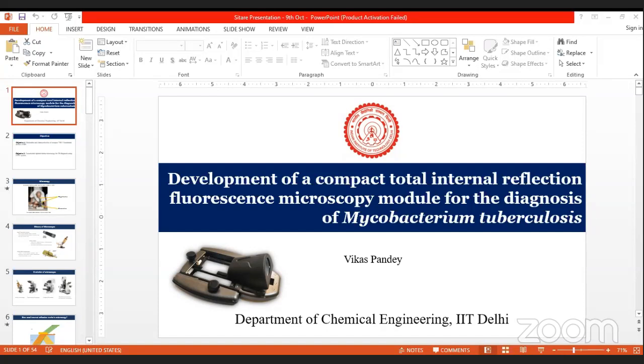However, there are bacilli present. Some are because of errors by the healthcare worker, or the way the slide has been prepared. It's all human error, or maybe conditional errors where the stain has not reached or has not been prepared well. These are the reasons we get a few false negatives.